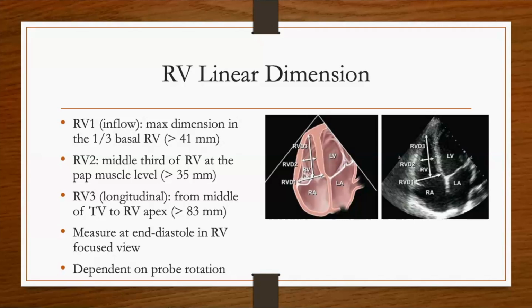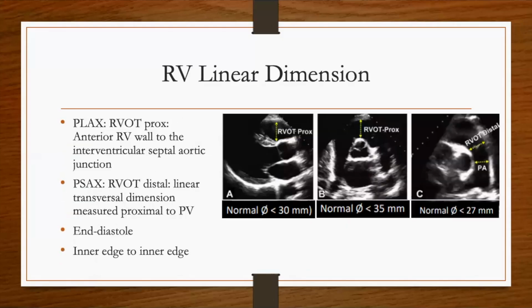Great. Whatever you said is right. Have you ever reported a finding on the RV? Yes, you can. Some of the other ancillary measurements that were shown are other measurements that you could use.